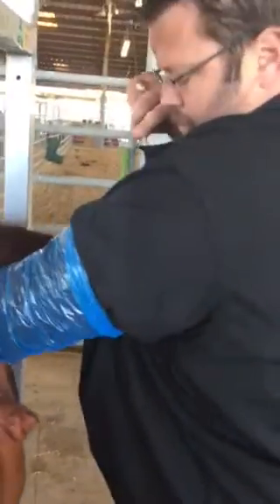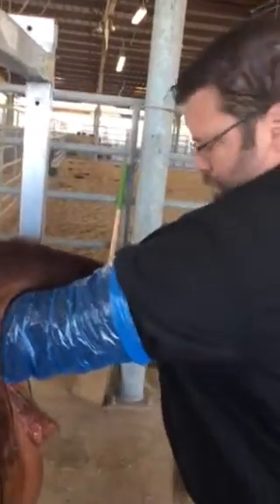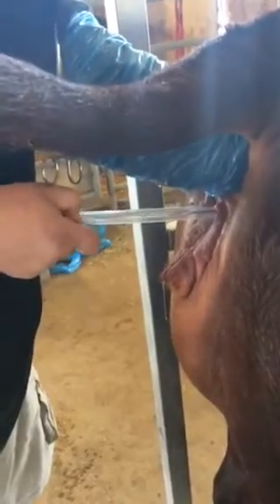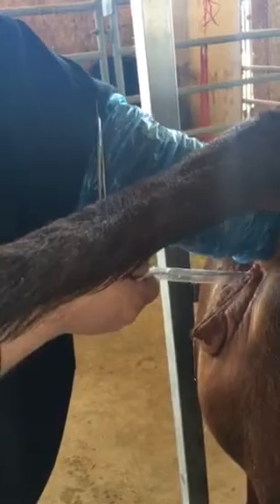Once I have it in my hand, I'm going to take this semen gun and enter it into her vulva. This has to be at an angle — don't go down, and then you kind of weave. Hold that tail. Once you're in, take this bag, this plastic, and you pull it from your gun. I keep this plastic on to keep the manure from contaminating her reproductive tract.